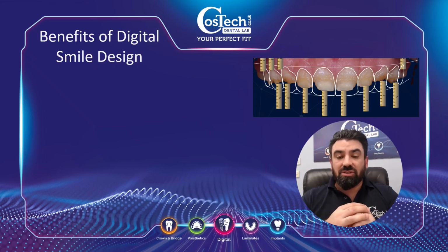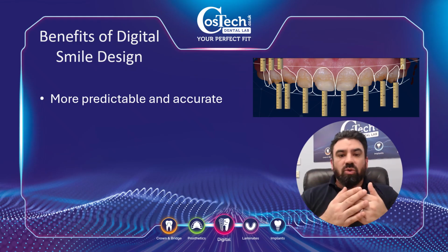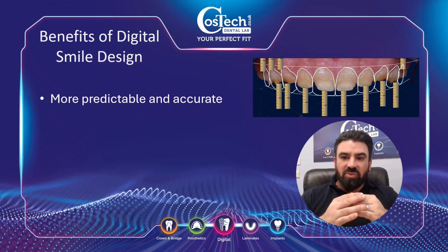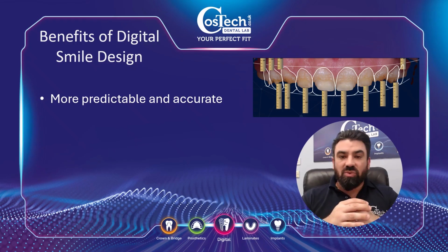Essentially it becomes very predictable and accurate because the CAD software is working within microns. We can say, okay, if I want to bring back the tooth by 0.2 mil, it will do it exactly 0.2 mil, whereas before we were using depth gauges through wax to work out how much thickness we were actually working with, using calipers.